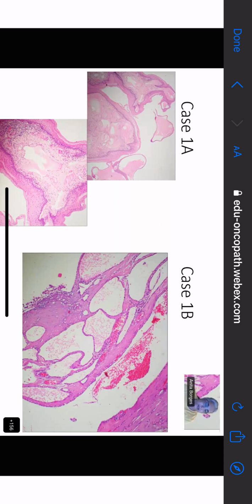We will be seeing it as a pale eosinophilic or a basophilic material. We can't say secretion. Oh my goodness, I see. So if I see, in the thyroid follicles, this thick, viscous thing, I cannot call it a secretion. Or if I see it in the glands of the skin, for instance, or anywhere, I can't call those things secretions.